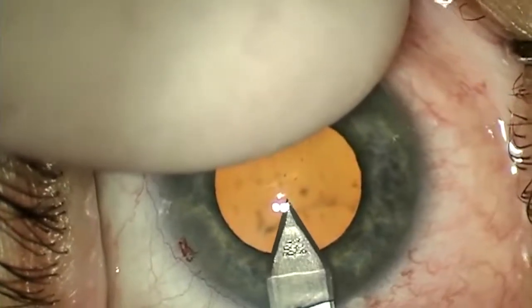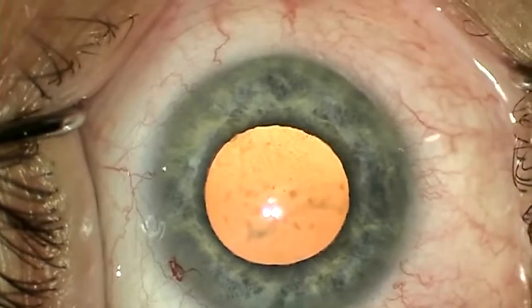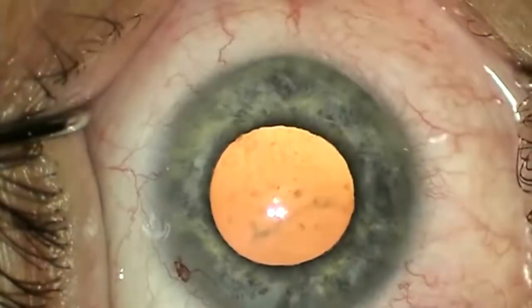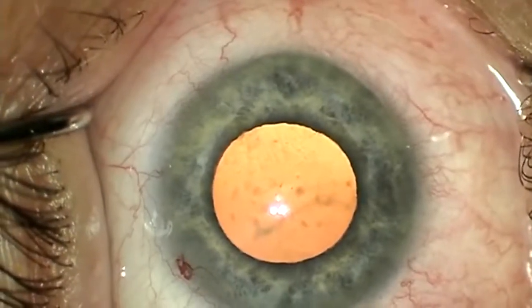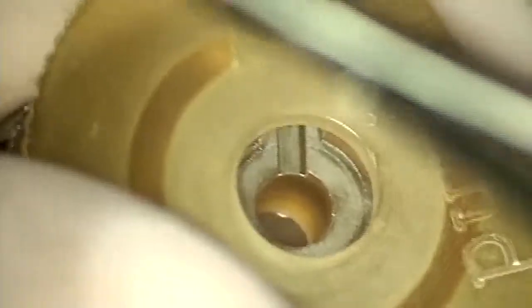I raise the microscope focus up to allow me to see through the hole on the top of the container and directly visualize part of the ring within the package. I habitually tap the container lid to make sure that the ring is resting against the base of the carrier and not stuck to the top. The top of the container is removed with a gentle twisting motion, keeping an eye through the hole on top watching the ring.